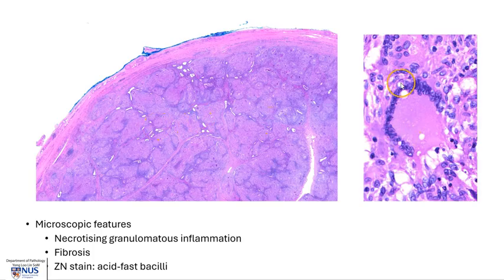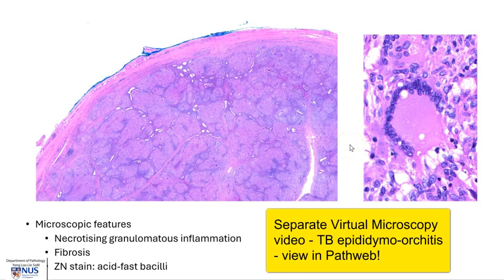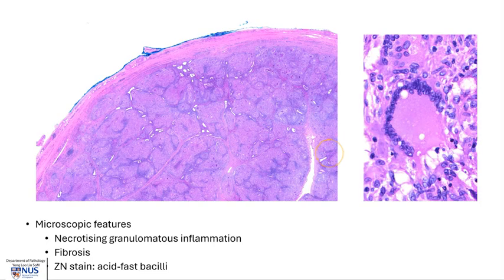Here is a high magnification view of a Langhans giant cell. This is a multi-nucleated giant cell where the nuclei are arranged in a horseshoe-shaped arrangement, and this is commonly seen in tuberculosis, though not a specific finding. There will be a separate microscopic video describing the features of tuberculosis epididymo-orchitis on virtual microscopy.